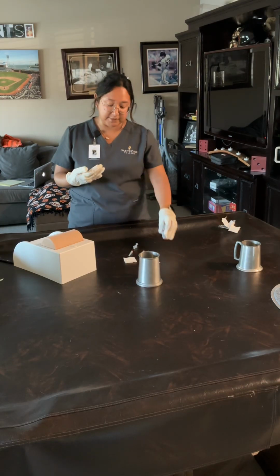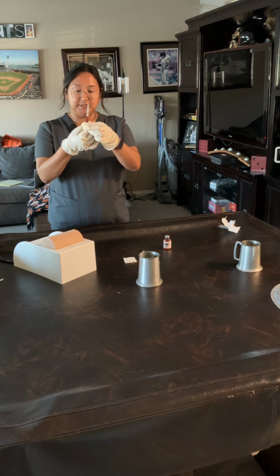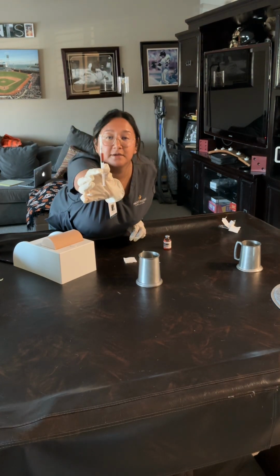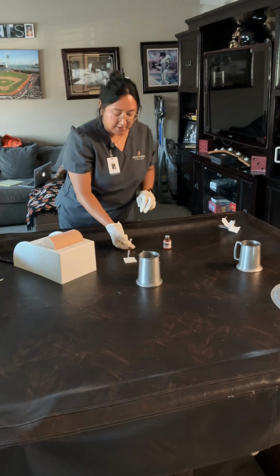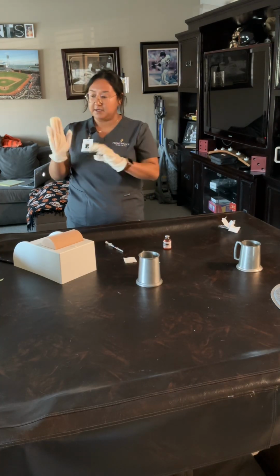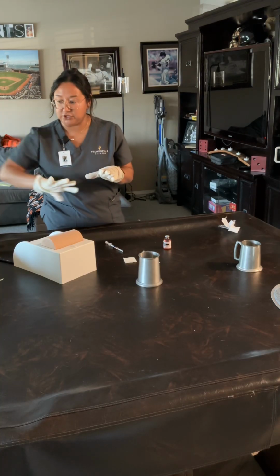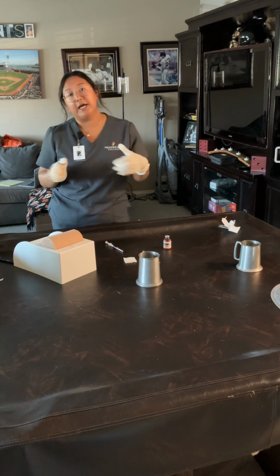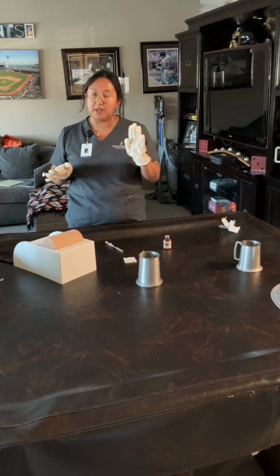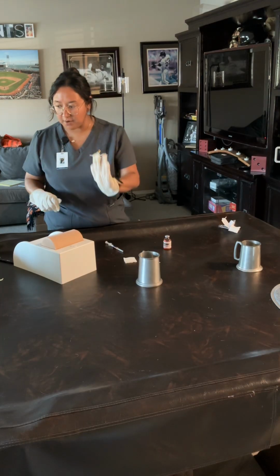Make sure I have the correct medication, the correct amount. Oh, I forgot to show you guys. There's 1.5 milliliters there. It's kind of hard to see, but there you go. And then next I will go ahead and check the placement. I'll ask the patient to go ahead and lie on their side and expose their hip and do some anatomical landmarks.